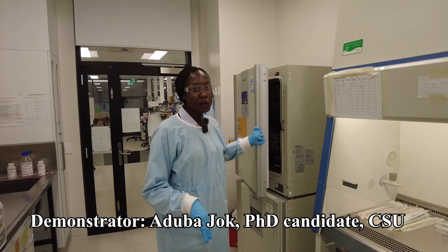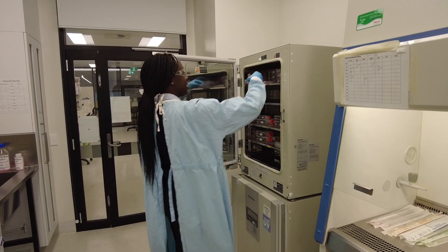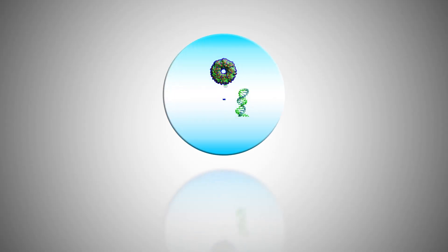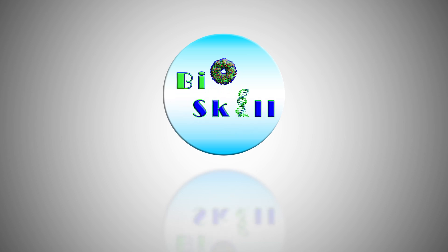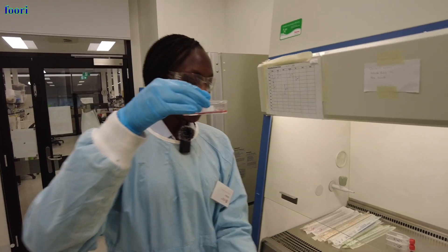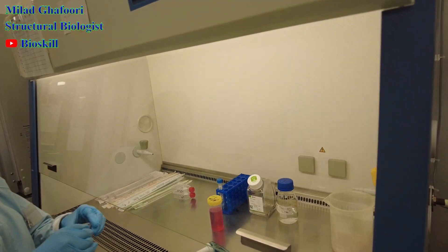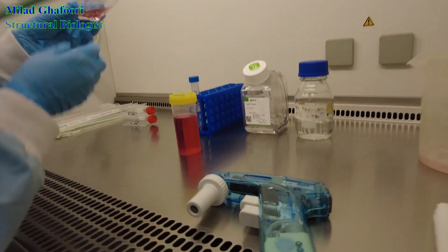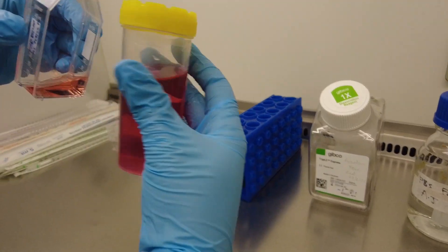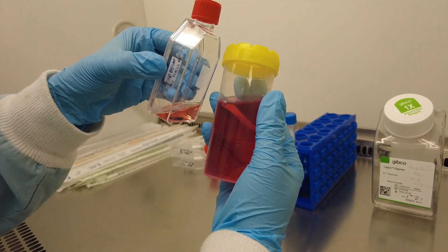Hi everyone. Today we're going to look at our normal colon cells, how they've grown, and we're going to split them today. We're going to compare the color change compared to our fresh media. As you can see, it's a little bit orange compared to the fresh media, so the pH is changing the color there.